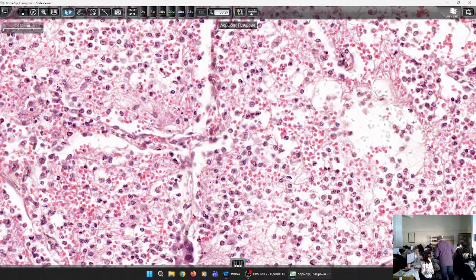And since the alveoli of a whole lobe communicate with each other, the inflammatory infiltrate may fill a whole lobe, so this is called lobar pneumonia. When we talk of pneumonia with no other adjective, we mean this type of pneumonia. That means alveolar pneumonia: exudate within the air spaces of the alveoli.